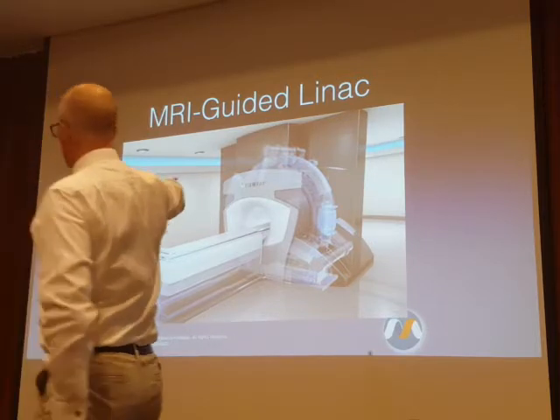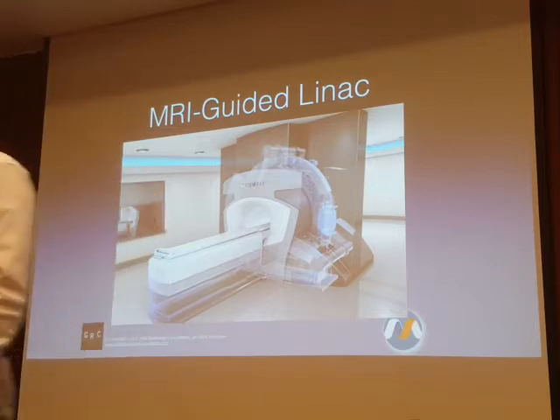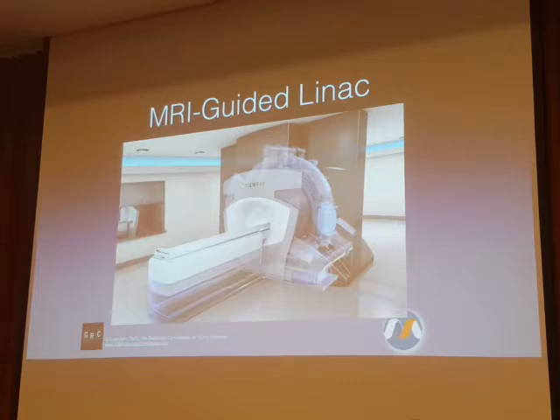So you can do linear accelerator beam therapy on a patient in the thorax, in the chest and abdomen, and it will automatically correct for respiration and pulse motion of the tumor down to within a couple of millimeters. It's really amazing technology.